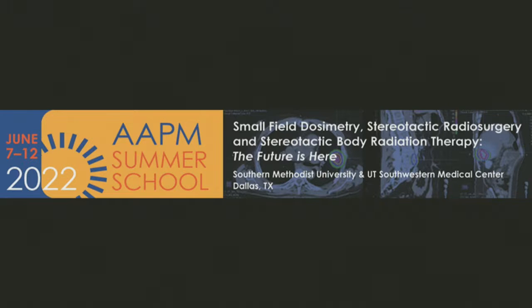Yes. So there is only so much we can do, right, with tools that are given to us. Some systems have some metrics that, for example, calculate the Jacobian of your deformation vector field. So if you have two adjacent voxels and one goes in one direction and the other one goes in the other direction, that's a no. It's not possible, right? Because the motion has to be continuous. So that's just one metric that you can look at in your algorithm.